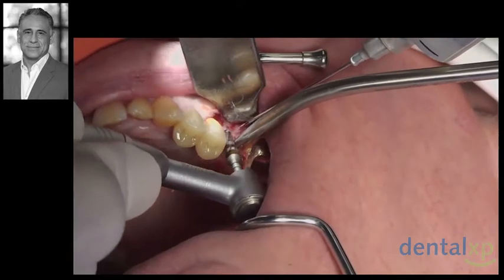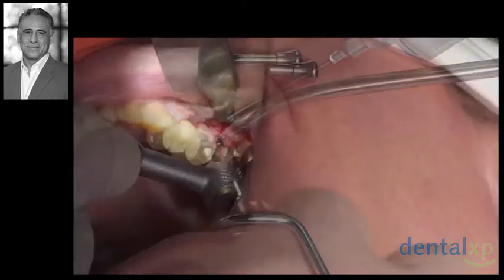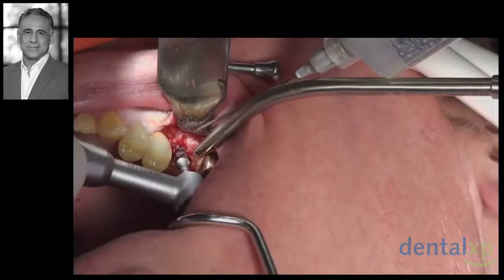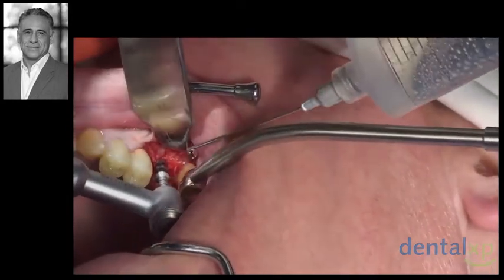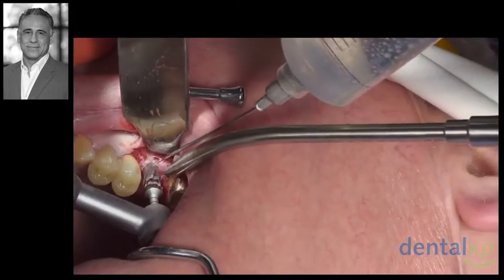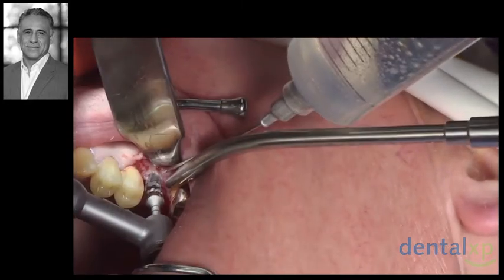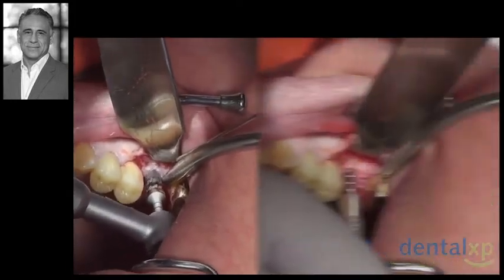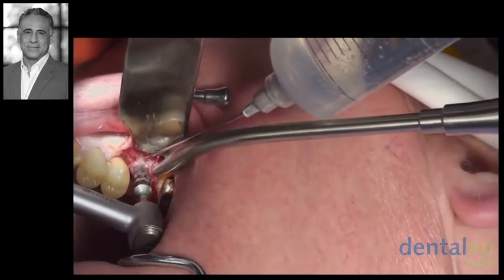We can also use it in the osteotomy mode to advance within the site if the bone is found to be particularly dense. Then we'll place the next size sinus osteotome and raise the floor again. We go back again to the osteodensification burr and continue the osteotomy and the densification process using wider burrs, slowly advancing it to about 12 millimeters. We'll go back and forth and keep raising the apical bone and densifying it in all directions until we have reached the right diameter and our desired height of about 12 millimeters. Using the densification burr in forward mode prepares the site, removing bone from the lateral and apical sides, and then immediately compacts it and moves it apically when it is reversed.